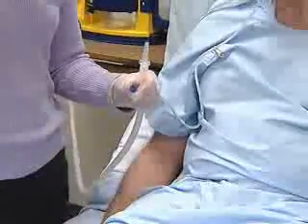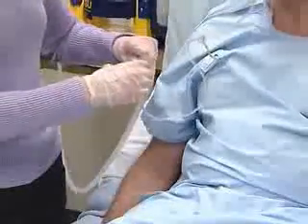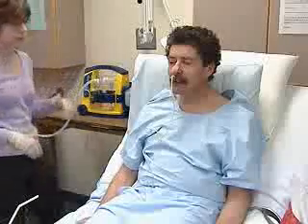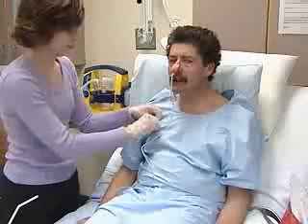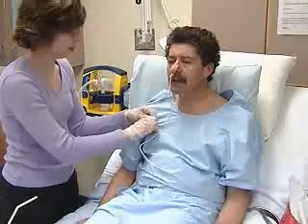Clamp the end or connect it to a drainage bag or suction machine and fasten the end to the patient's gown. The head of the bed should stay at an elevation of 30 degrees to prevent reflux and to minimize irritation of the posterior pharynx. The patient should find the discomfort eases in a little while.